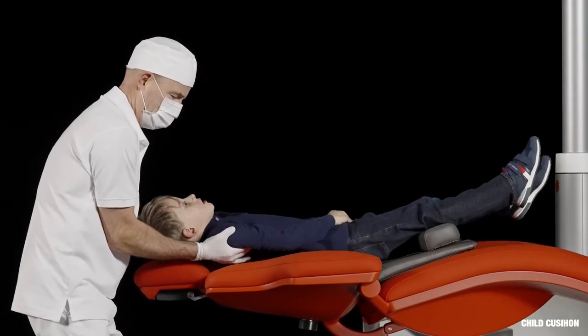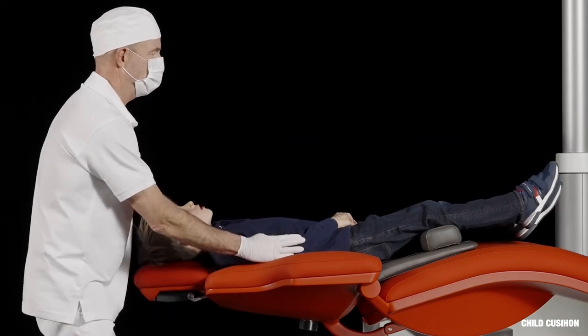For treatment of children, use the child cushion and place the child's head on the neck rest.